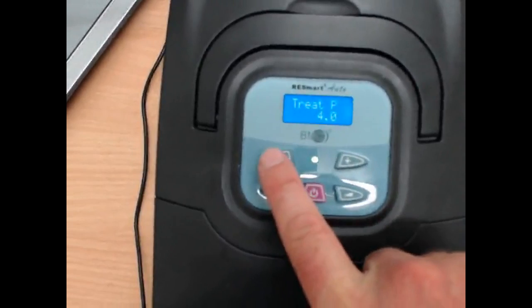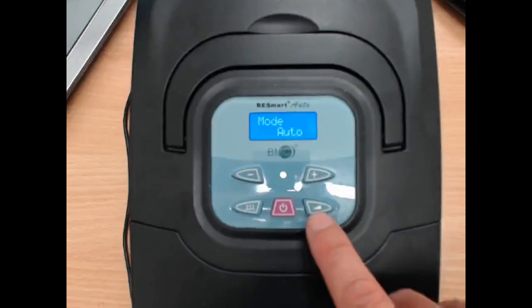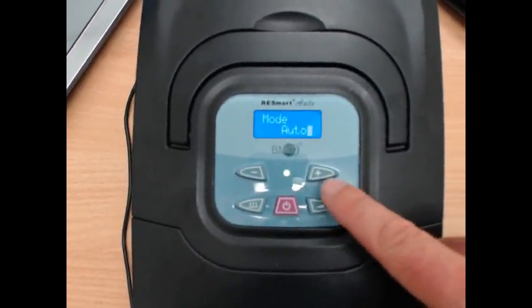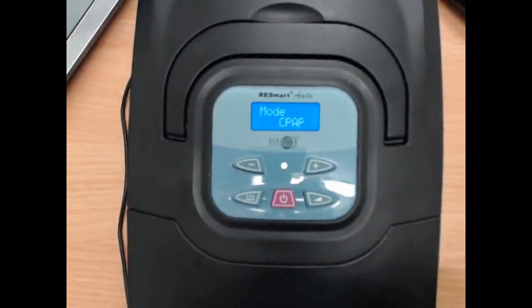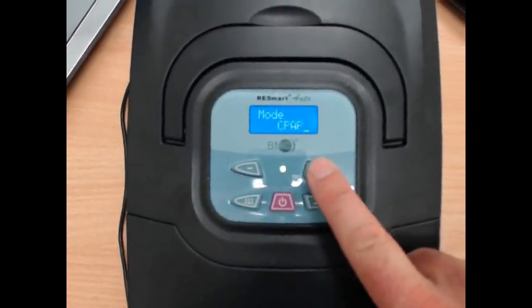So I'll just show you how to change it. Say at the moment we've got automatic, and we want to change it to fixed pressure. We click this button down, there's a bit of a theme here. It starts flashing, then we can click mode CPAP. Click this button again, and now we've just changed it to CPAP mode. Okay, we're going to go back to auto for this, so I'm going to show you mode auto.